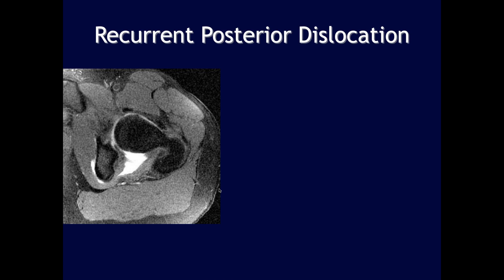In the next case, axial images of the hip show a history of recurrent posterior dislocations. There is diffuse blunting and irregularity of the posterior labrum, compatible with chronic tearing and blunting due to recurrent dislocations.